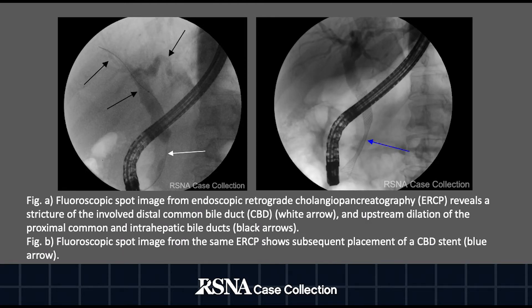Figure A: fluoroscopic spot image from endoscopic retrograde cholangiopancreatography reveals a stricture of the involved distal common bile duct, denoted by the white arrow, and upstream dilation of the proximal common and intrahepatic bile ducts, shown by the black arrows. Figure B: fluoroscopic spot image from the same ERCP shows subsequent placement of a CBD stent, denoted by the blue arrow.